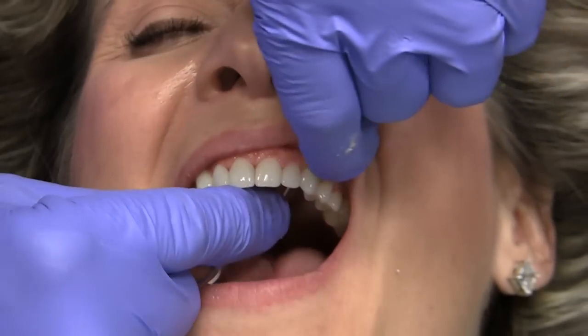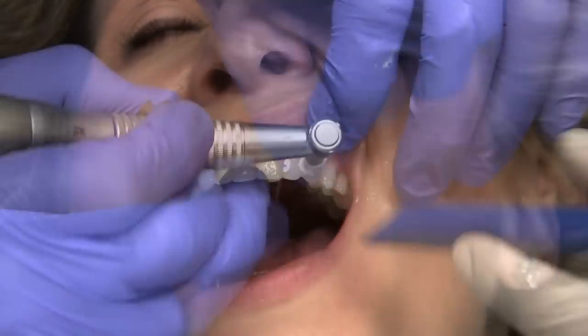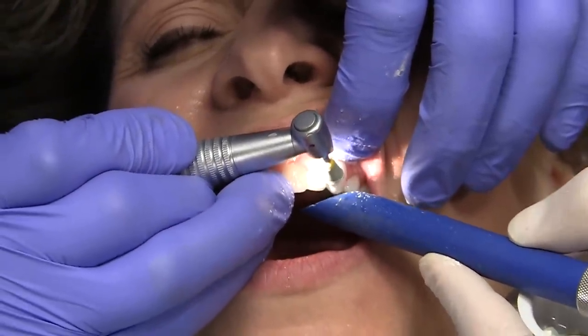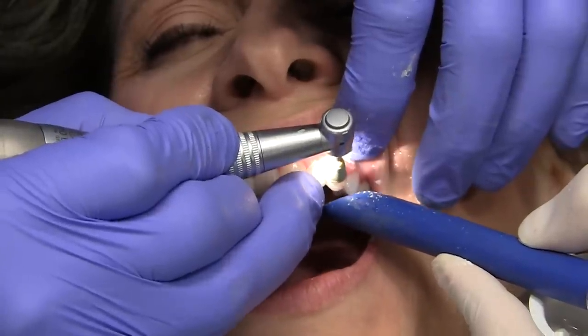Check the interproximal surfaces for smoothness using dental floss. Continue with the porcelain laminate polishing paste using the polishing cup. Use the side of the cup and have the assistant follow the doctor with a high-speed evacuation tip on.